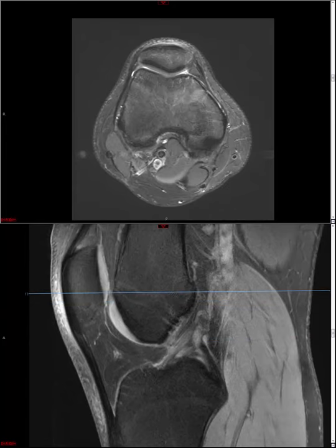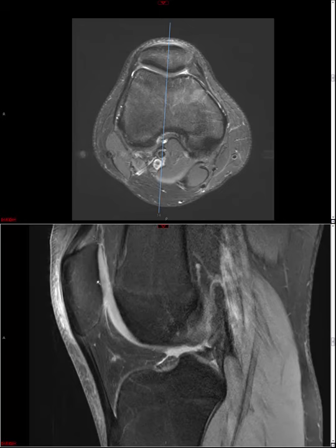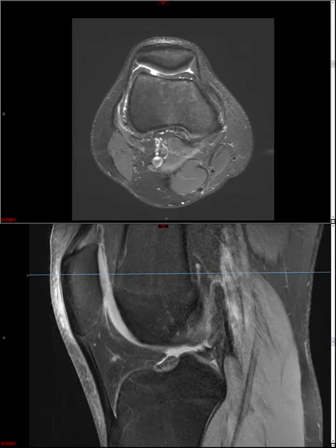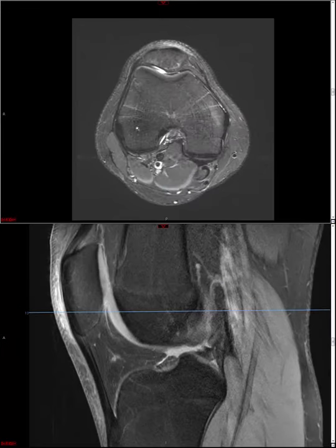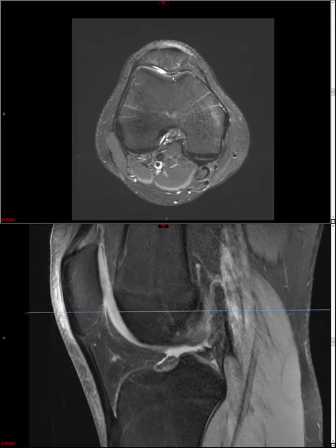And when I'm assessing, I assess cartilage by compartments, and we'll just start with the patellofemoral compartment. When I'm assessing a compartment, generally I like to talk about whether the chondrosis is generalized, the whole compartment, or if there are focal areas. And if there are focal areas, and it looks like it might be acute with osteochondral injury, for example, if we think this is a case of osteochondritis dissecans, then I might give measurements and I'll look for an osseous fragment either in situ or displaced.